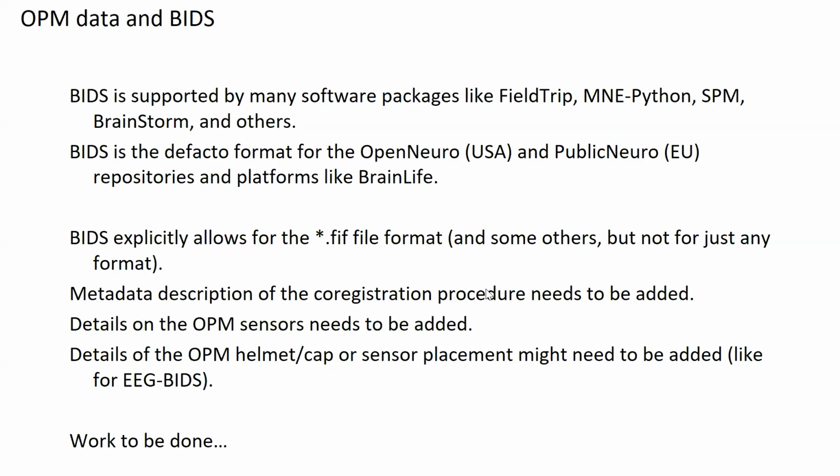BIDS is a standard. BIDS is being extended all the time. With different extension proposals, new modalities are being added to BIDS. But the FIF file format already is allowed with the BIDS standard. Other file formats could be added to BIDS, but at this moment they're not part of the BIDS standard. So that's why I'm encouraging people to work with the FIF file format.